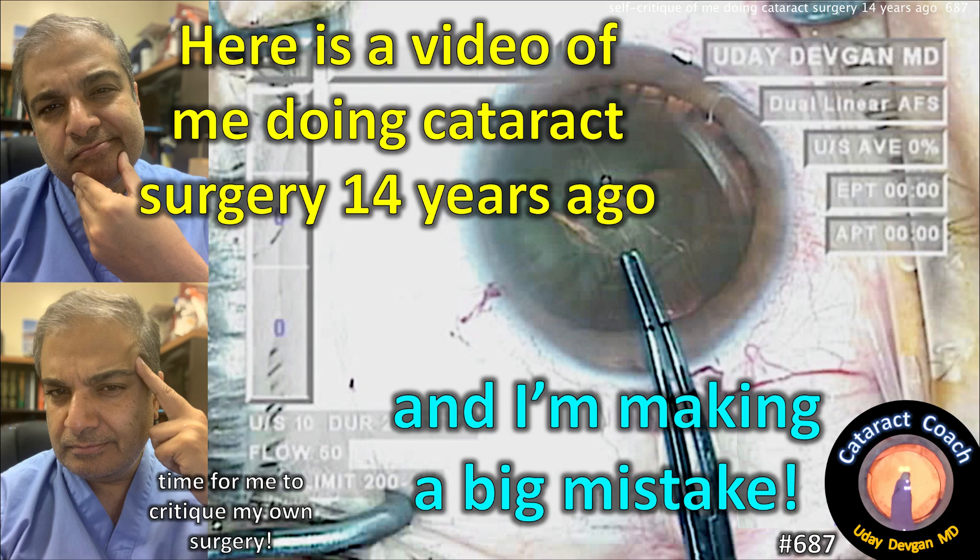CataractCoach.com. Here's a video of me doing surgery 14 years ago, and I think I'm making one big mistake.